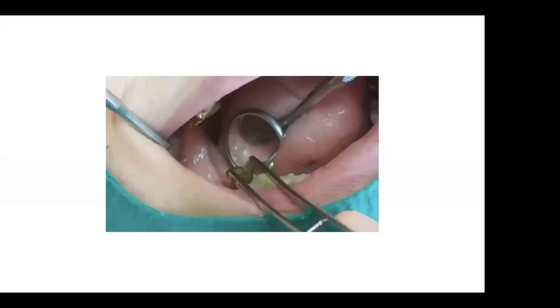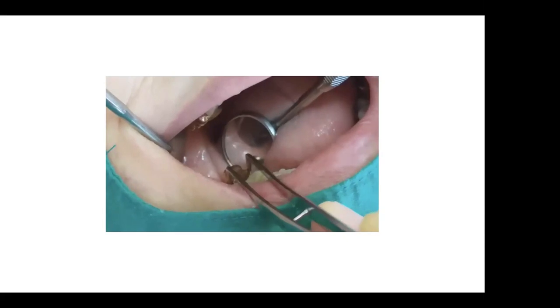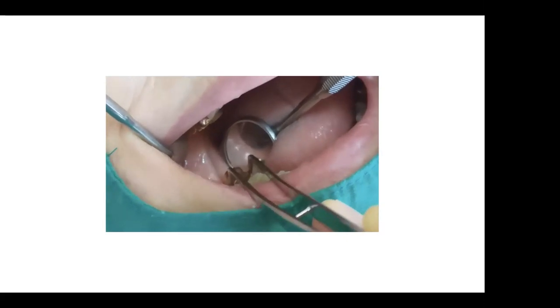This is one of the patient's cases. He came in pretty late afternoon one day and said the implant is really loose. As you can see, although they're 2 units splinted crown, what I had to do is prepare an access opening to get to the top of the screw and retighten it.